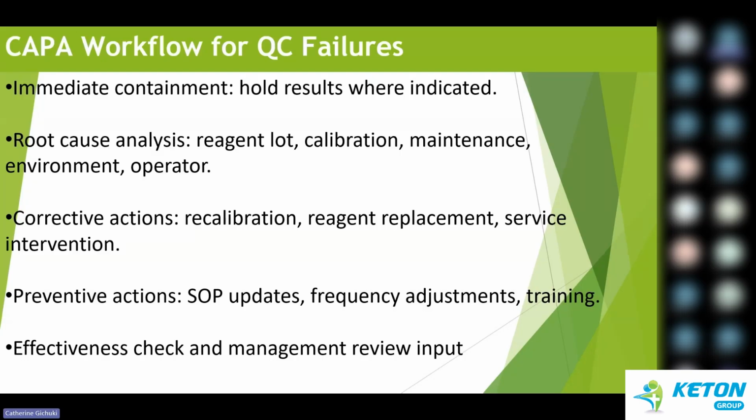That is what we're calling frequency adjustment, and then training. That is just to ensure that the same problem does not happen again. Then we check on the effectiveness and management review input. Confirm if it worked and report to management.